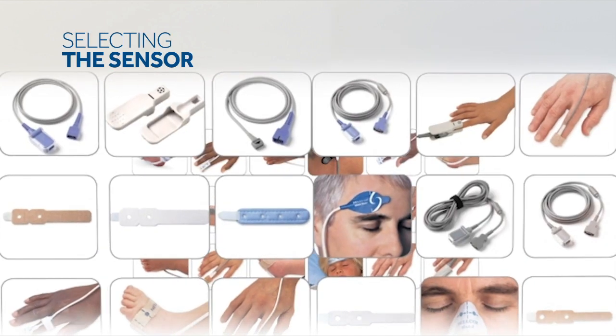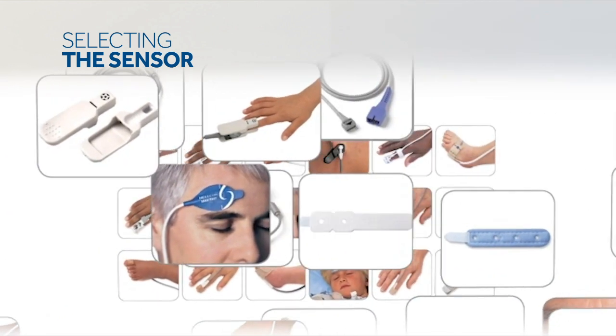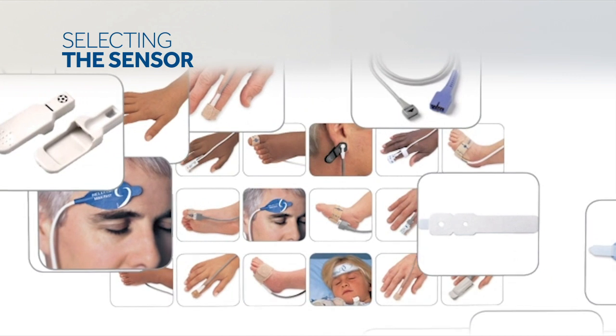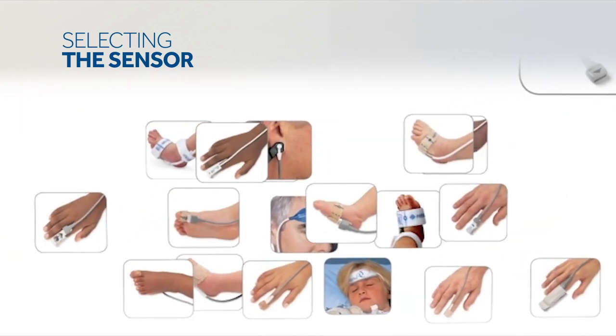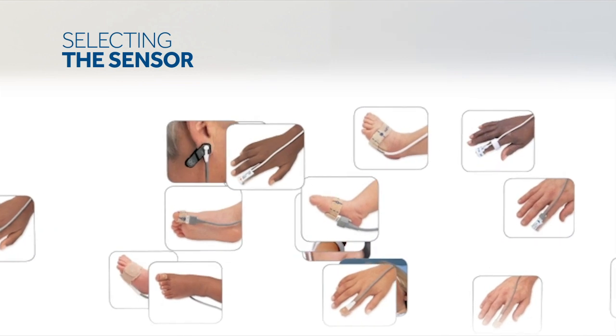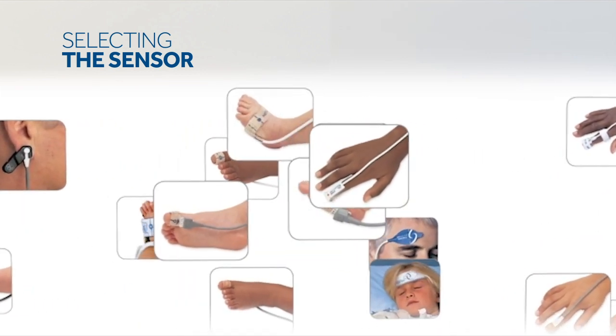Select a compatible Nellcor pulse oximetry sensor for the patient and desired application. When selecting a sensor, consider the patient's weight and activity level, adequacy of perfusion, availability of sensor sites, need for sterility, and anticipated duration of monitoring.